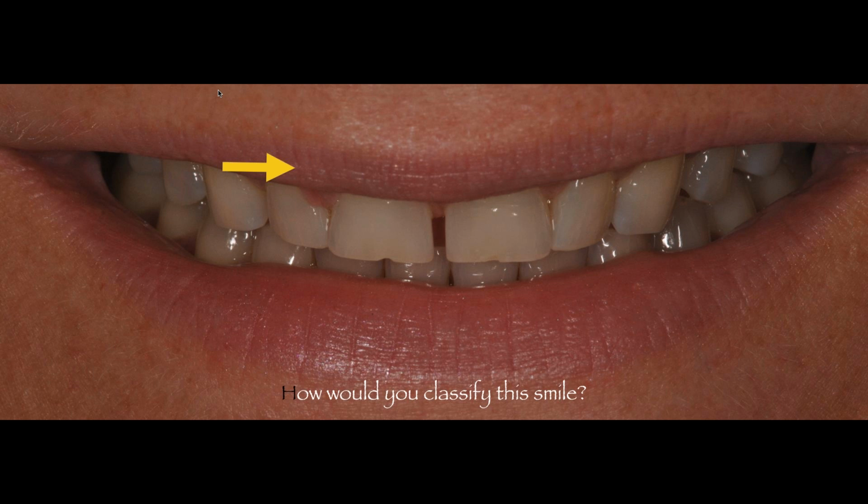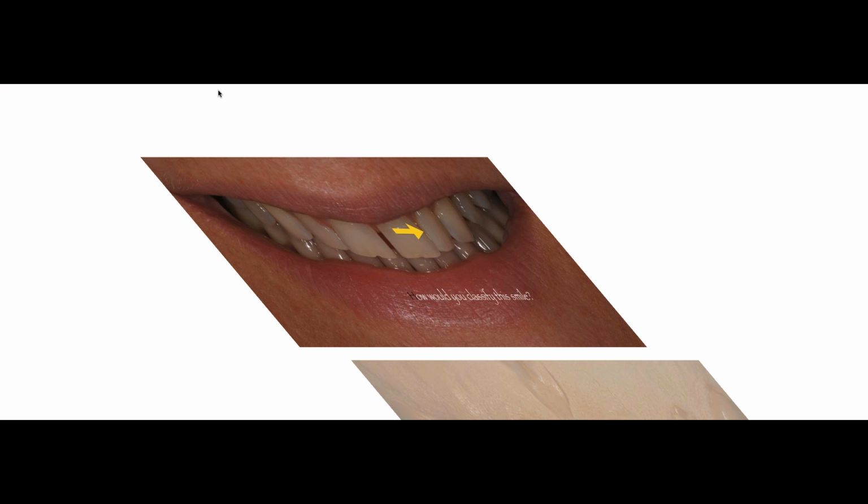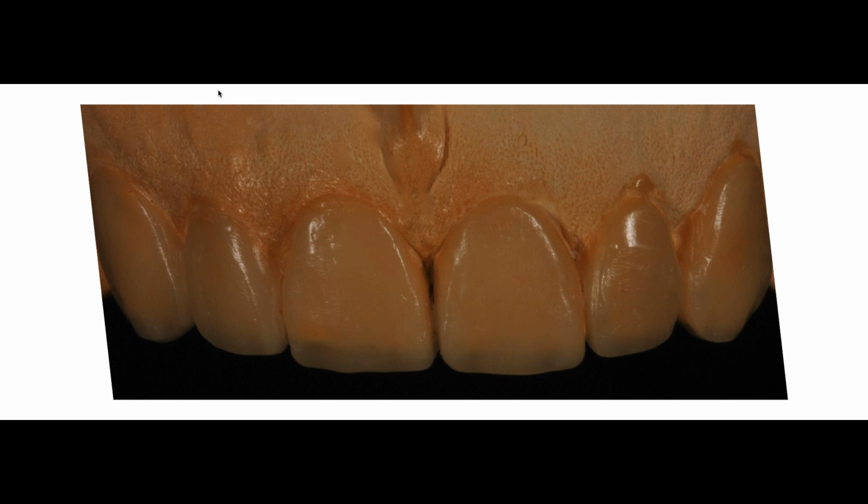Then the other thing that I can view in this photo is that the patient has a diastema. And actually, the patient came to the practice initially because she wanted that diastema to be closed. So you can see in this photo, we have a very broad spectrum view of the patient, and we can really plan what it is that we can offer this patient. And there is the hypertrophic papilla that the patient presented.